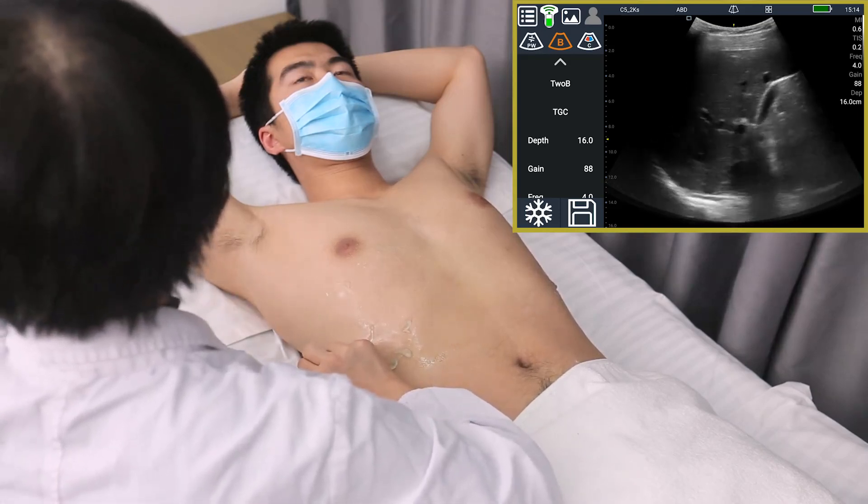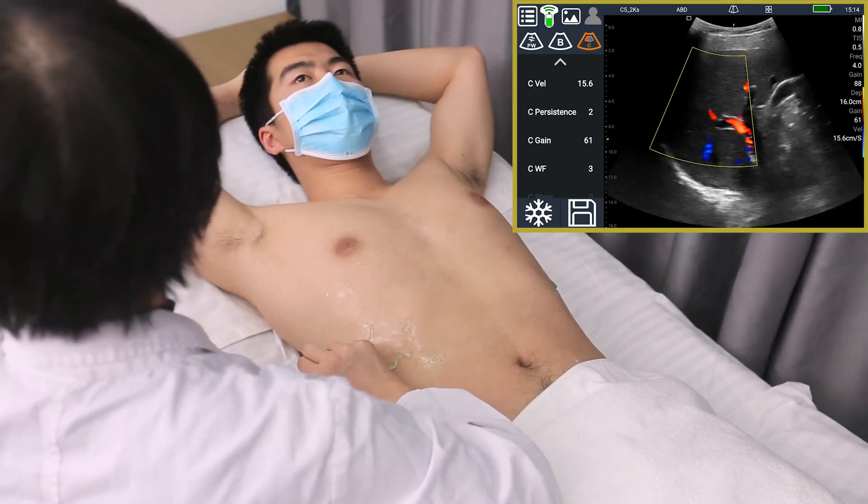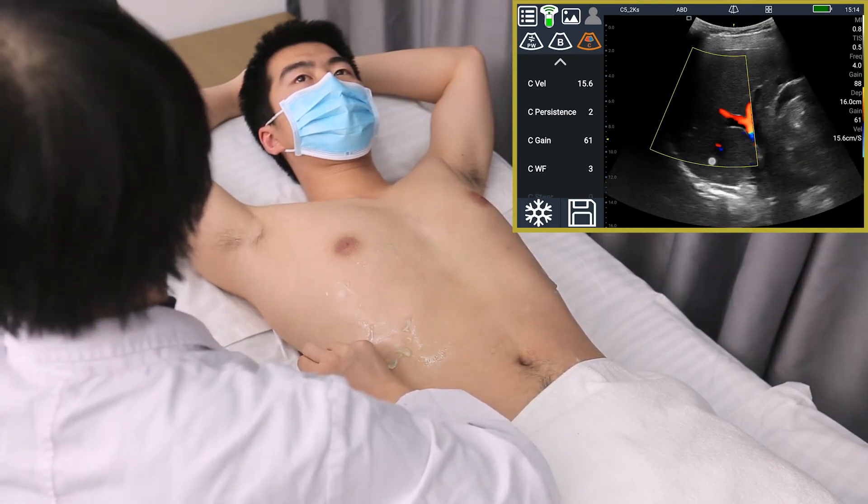In color Doppler mode, we can observe and measure the blood flow of the hepatic vein and portal vein.